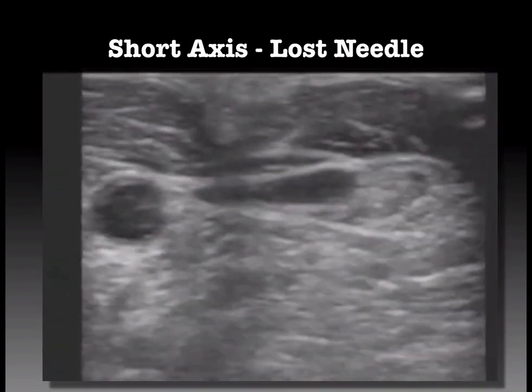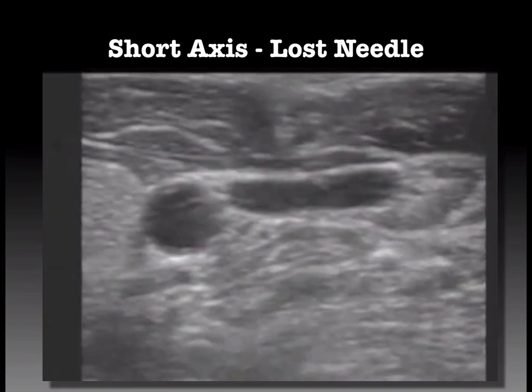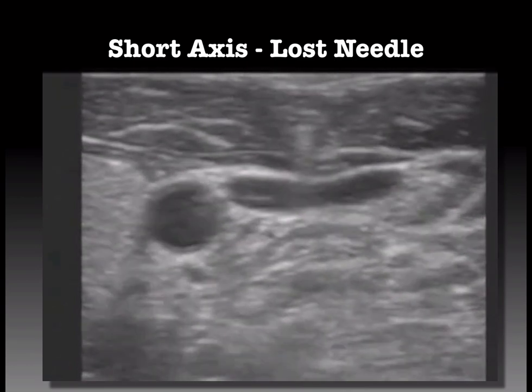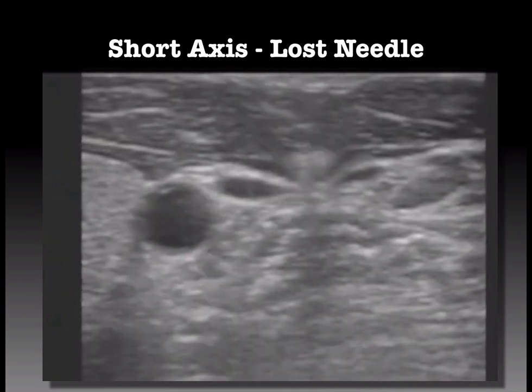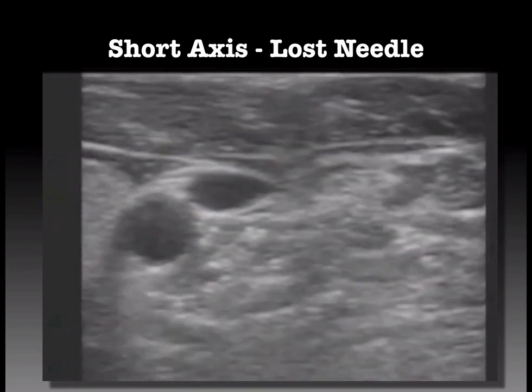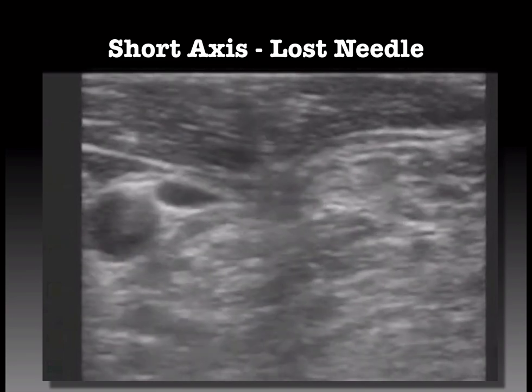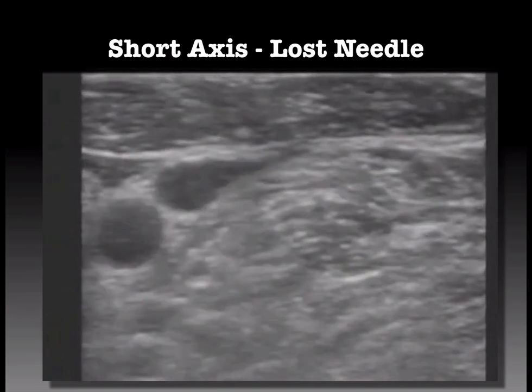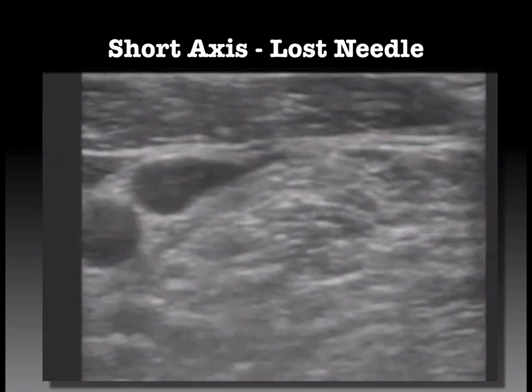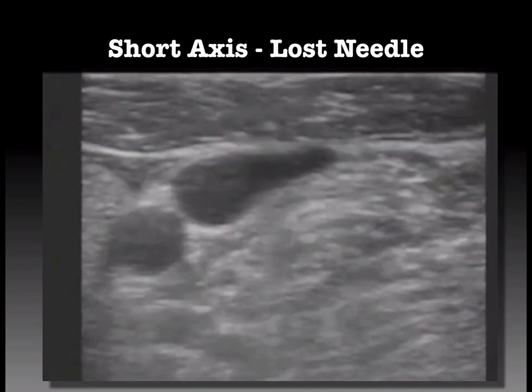So here is one of those. We have the internal jugular vein in the middle, and we have the carotid artery off to the side, and this is a hubbed central line needle. That IJ is 1 centimeter deep and it's 1 centimeter thick, and this 10 centimeter needle is all the way to the hub. So the needle tip is off the screen. We don't know what that needle tip's doing. We see movement of the needle, but that is the needle shaft going through the vein. That is not the needle tip. So again, we want to walk that needle tip all the way down, imaging the needle tip the whole way to make sure that we're doing a true dynamic procedure.